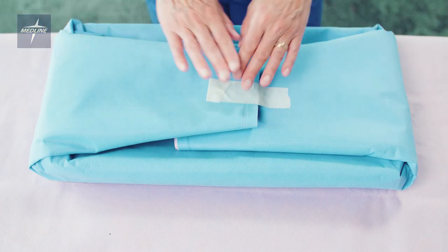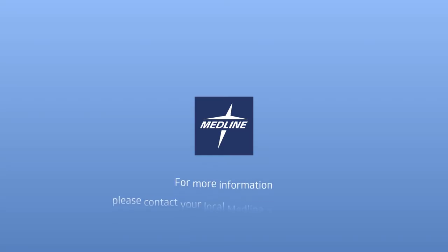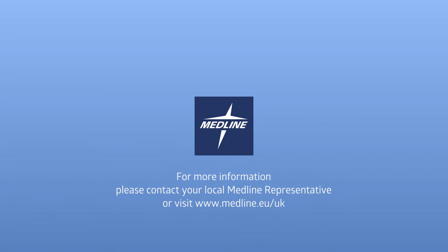The set is now ready for the autoclave. For more information please contact your local Medline representative.